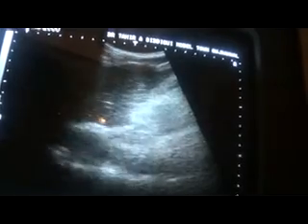Now, below the costal margin when I sweep — give a sweep to the probe — I don't see the right lobe of the liver below the costal margin. Whereas in the subcostal region, just below the xiphoid process, I see the left lobe of the liver. So what I am going to report is that in such a liver there is generalized reduced total surface area of the right lobe with normal dimensions of the left lobe. This is the fluid surrounding the liver.